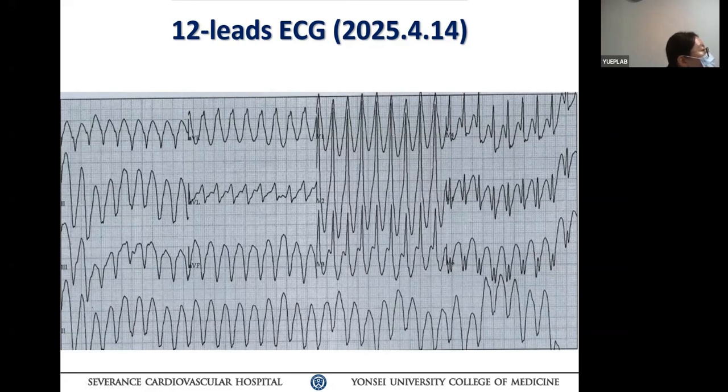ventricular tachycardia. The QS morphology in the inferior leads also makes me consider a crux origin as a possible differential. I also agree that the transition point is around V5, so V4 to V5, which suggests a more apical towards lateral position. So possibly an apical crux VT as a differential. Okay. Anybody else, any more?